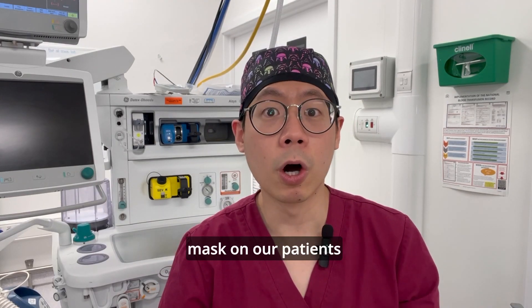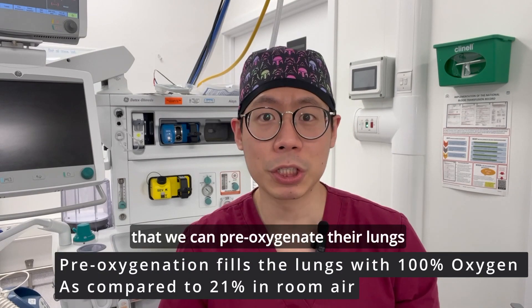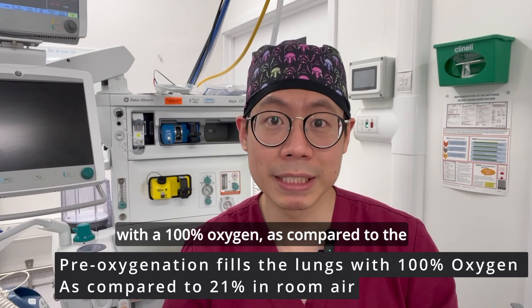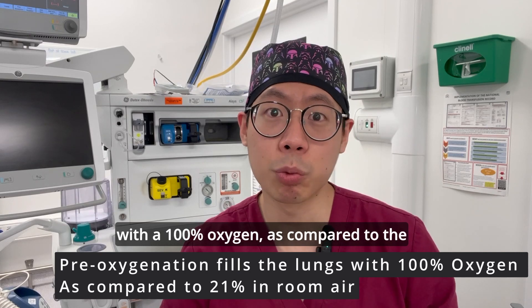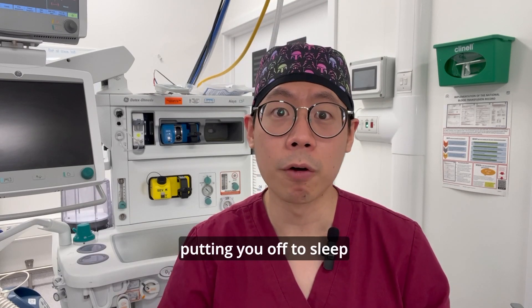Now the reason why we put a face mask on our patients before we drift them off to sleep is so that we can pre-oxygenate their lungs with 100% oxygen, as compared to the 21% which we're breathing in room air, in preparation for putting them off to sleep.